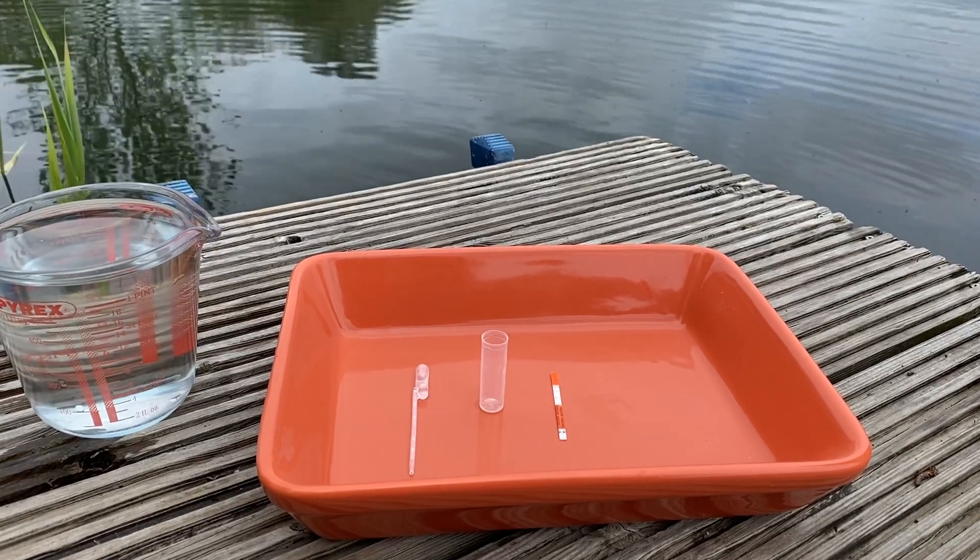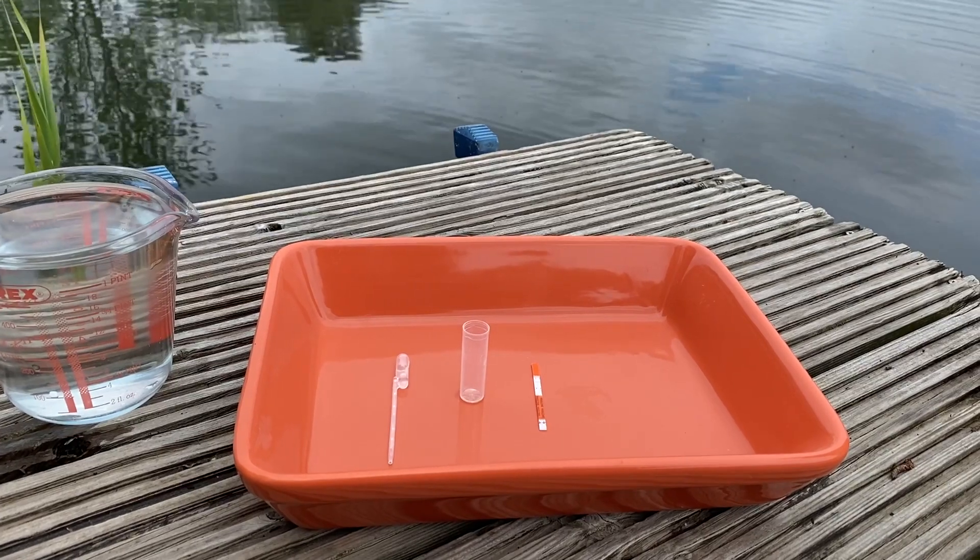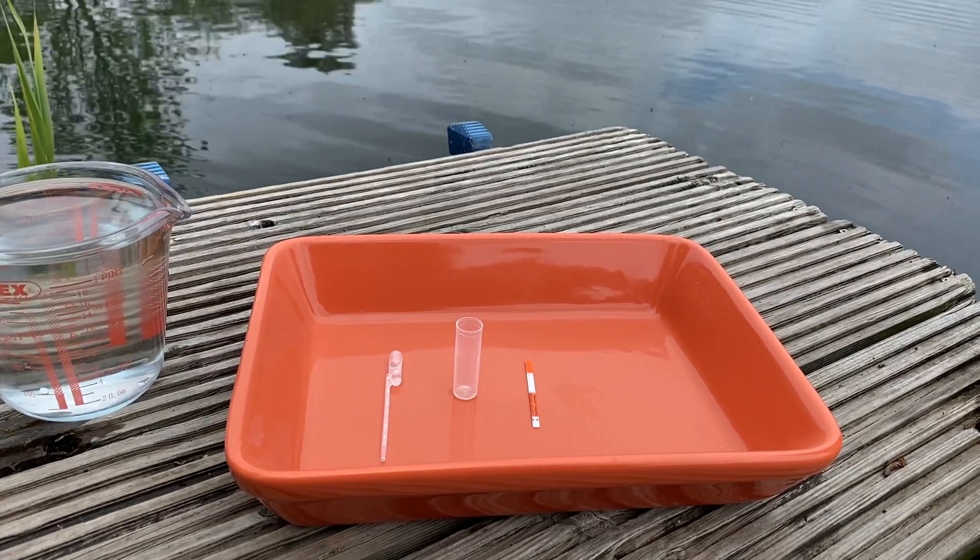Hi, this is John from Simplex Health. Today I just want to quickly demonstrate the 15-minute bacteria test for open water swimming.